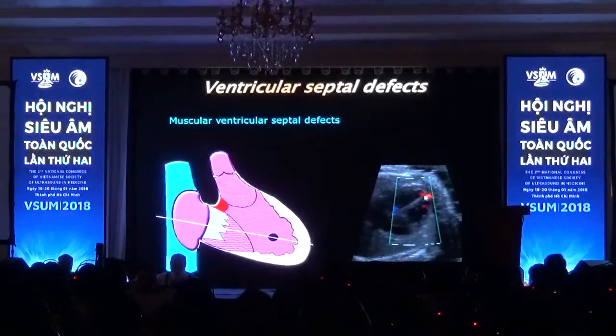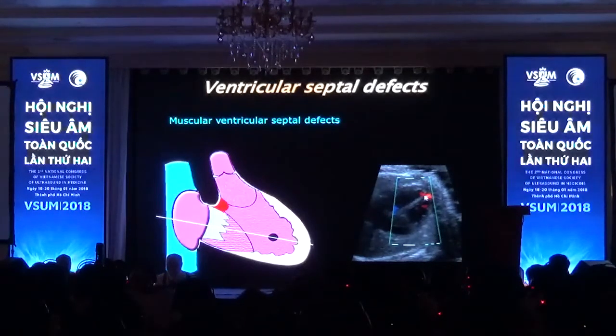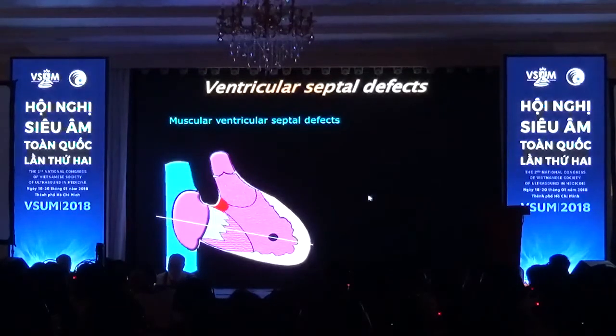So I want to urge you that every time you do a four-chamber, you have to put color on if your machine has it. You paid a lot of money to get this color button on your keyboard. Use it, okay? So look for that.